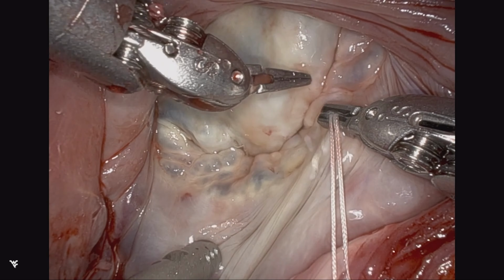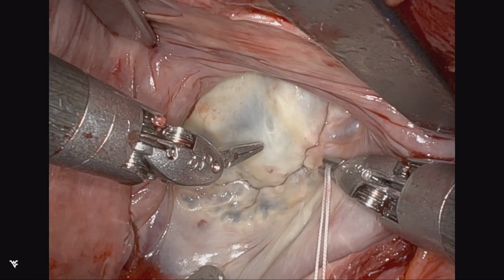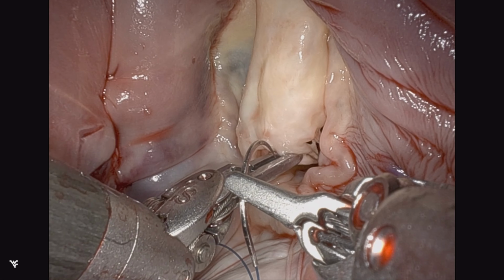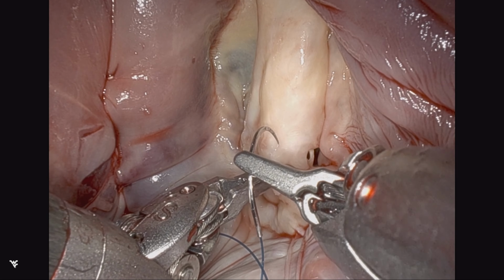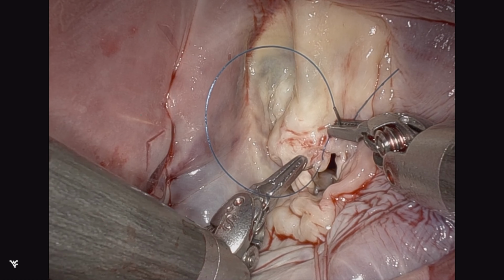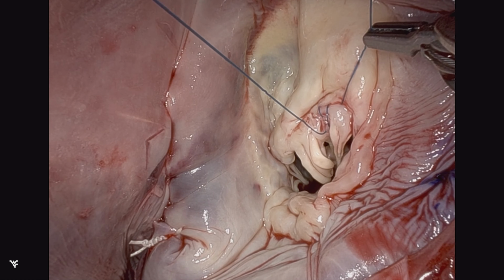As you can see, just by anterior leaflet release of the secondary chordae that you could probably see on the 3D vision of the TEE with some restriction and puckering. In this case, we had some robust chords at A2, and we're just reattaching them. It's fairly straightforward, does not burn any bridges, and it is something that can be done in a fairly focal manner. Again, one of the advantages of robotic surgery, one can get underneath the anterior leaflet and see all of these very, very beautiful.